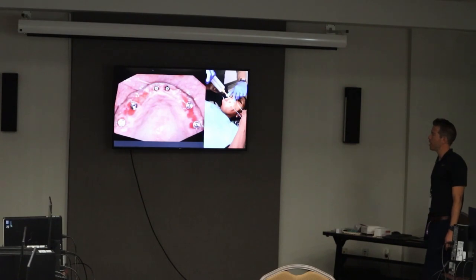Here's the ridge at three months — we took the temporary off and it's just this big fat ridge, tons of keratinized tissue. Didn't suture anything. The multi-units end up right at tissue level. She was happy with her temporary; the teeth were where they needed to be — not big changes, pretty easy just to restore this.